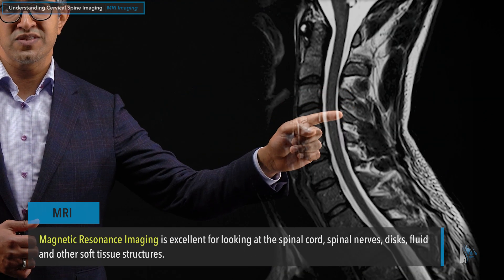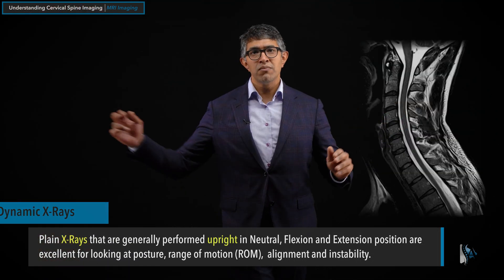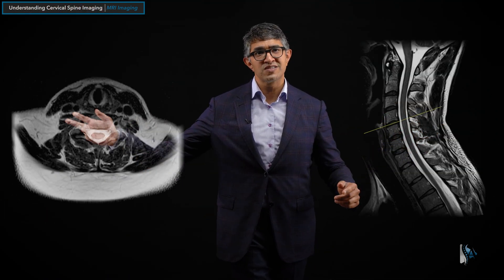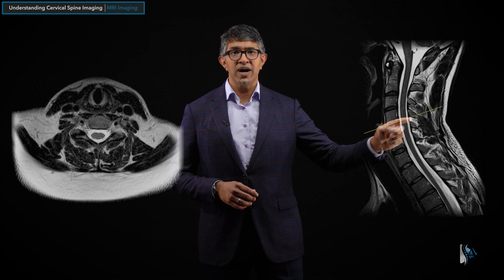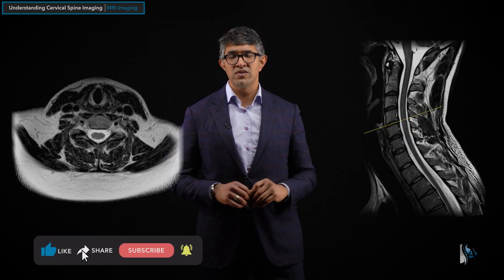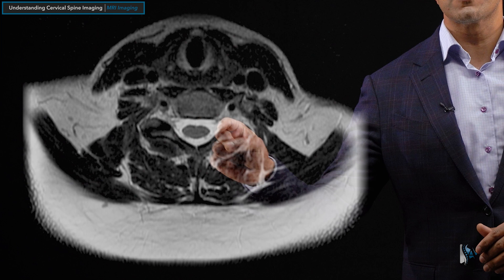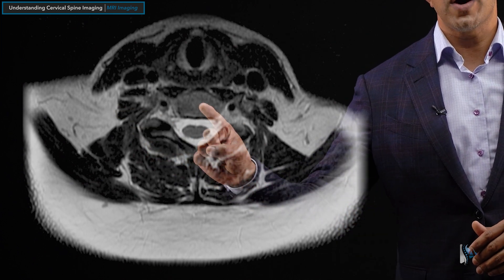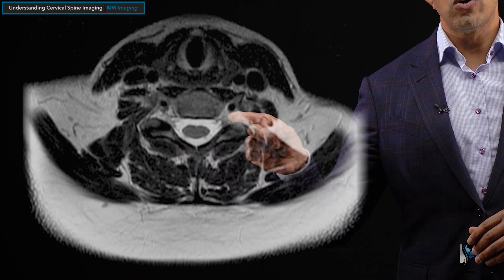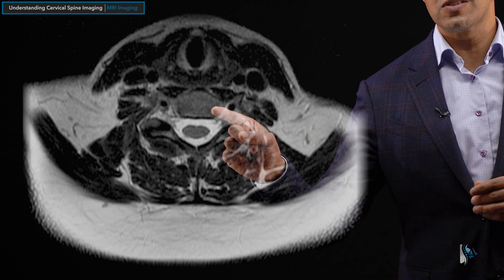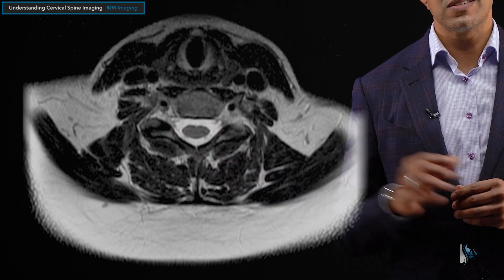There are also the structures in the back — the spinous processes, some of the ligaments. You can also see the back of the neck, some fat, some muscle. If you take a single slice, say right here, it would look like this — an axial T2 MRI right at C4-5. You're standing at the feet, looking up at slices, so the left side is over here and the right side is over there. You can see the spinal cord right here, and the nerves that leave on the left and right sides. When looking at the axial sequence, we see the spinal cord, the fluid around it, and the nerves as they exit.